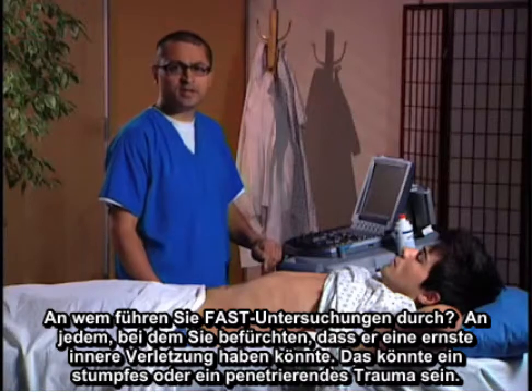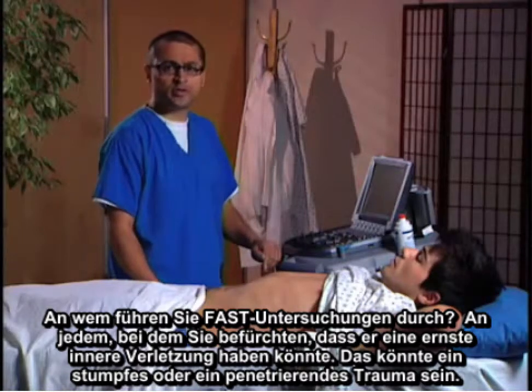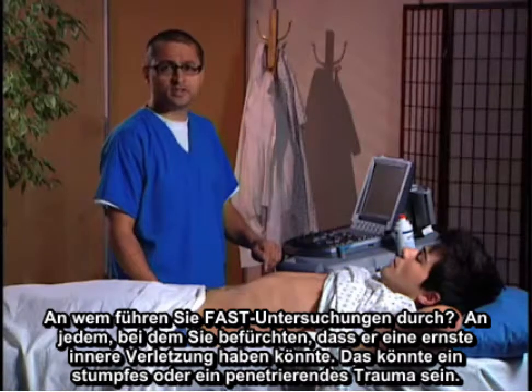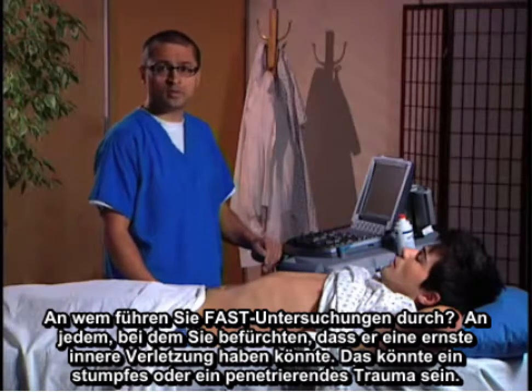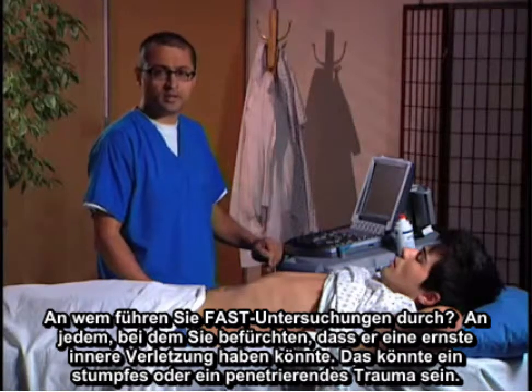Who do you do a FAST exam on? Anyone that you're worried about serious internal injury — that would be a blunt trauma or a penetrating trauma.